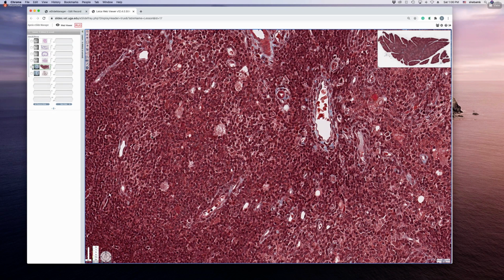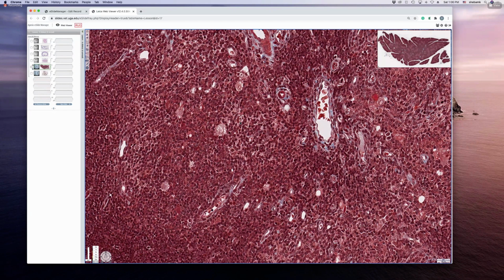So that forms the parenchyma or the stroma of the thymus. The stroma, okay? Because this is like the scaffold. Look at that one there, a big, pale nucleus. That's an example of a stromal cell. So what are these stromal cells called in the thymus? Epithelial reticular cells. Awesome, epithelial reticular cells.